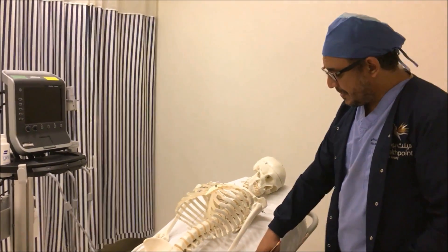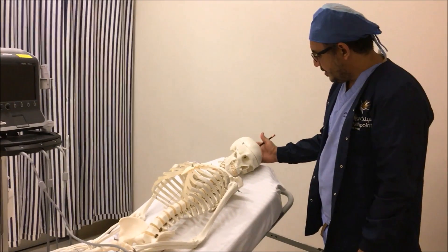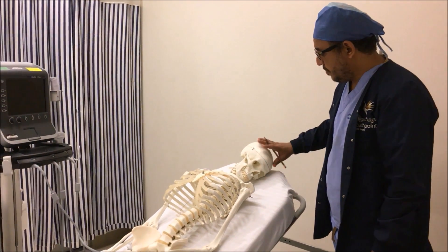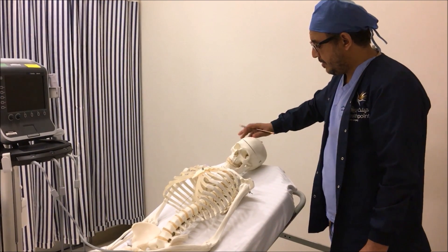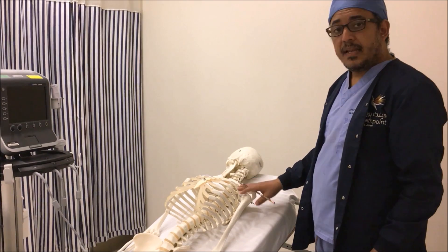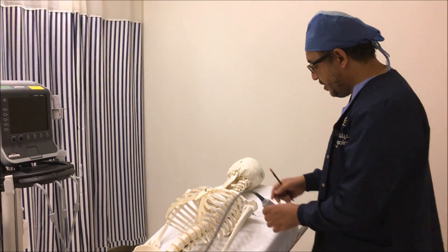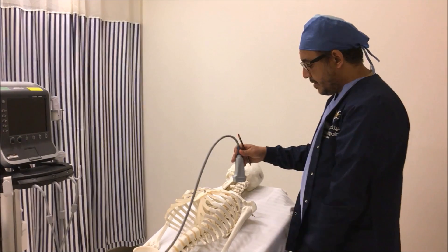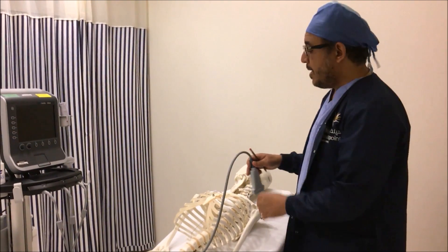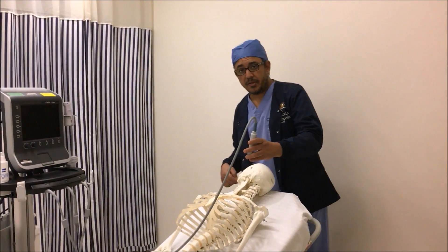In all our limb blocks, we place the patient in supine position with the head almost on the edge of the table. If you are doing the left side, we push the head to the right side, and opposite if going the other way. If the block side is the left side, I prefer to stand on the left side of the patient, facing the ultrasound machine in front of me. If doing the right side, I stand toward the head of the patient.